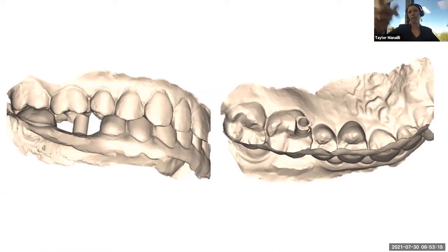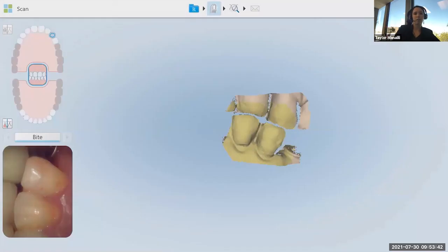So I know that obviously the scan body is not sticking through the opposing arch, but when we look down from above, kind of that axial view as you would on an x-ray, we see it popping through that top tooth. So that's obviously not there. It's just superimposed from the software, but we do want to go through and make sure that the patient is biting all the way down.